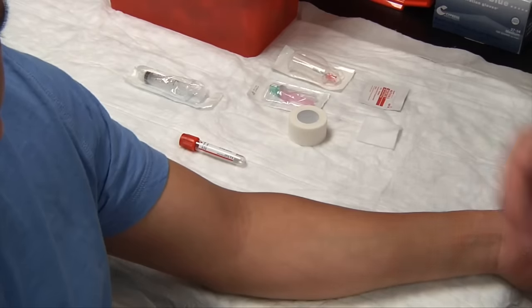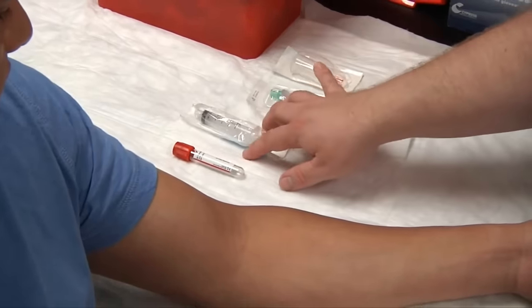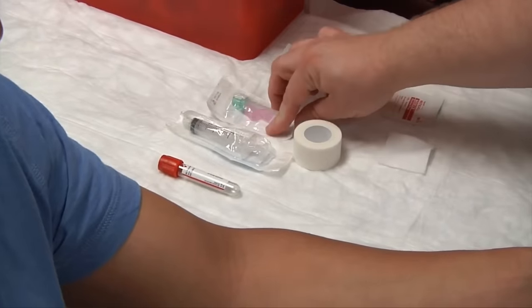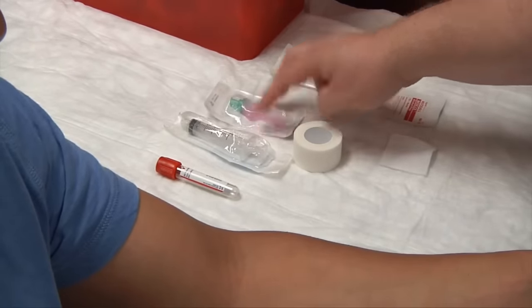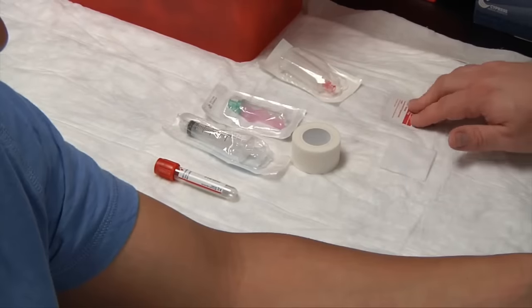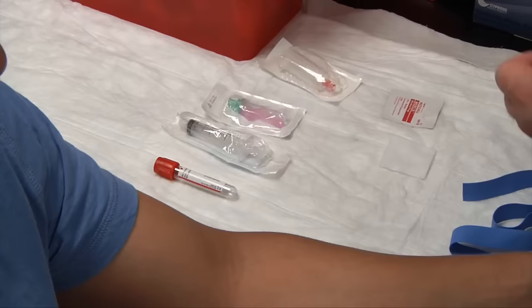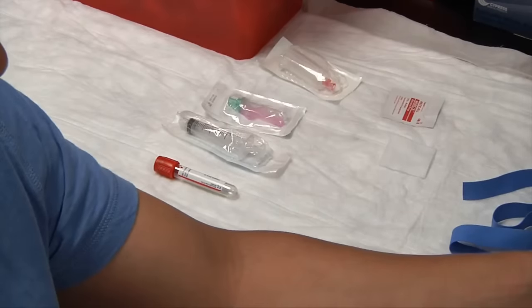The equipment that we're going to need is our evacuated tube, a barrel syringe, a hypodermic needle with a safety cap, a transfer device, gauze, alcohol swabs, and of course our tape. Let's go ahead and tear off a piece of tape and put that on the corner of the table.